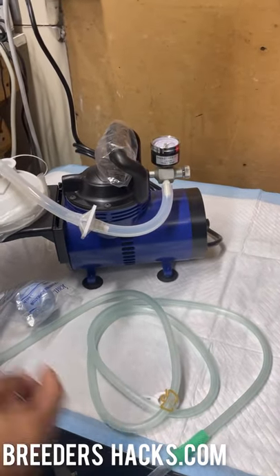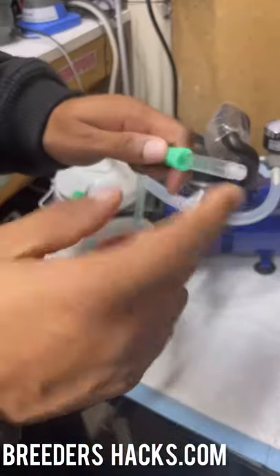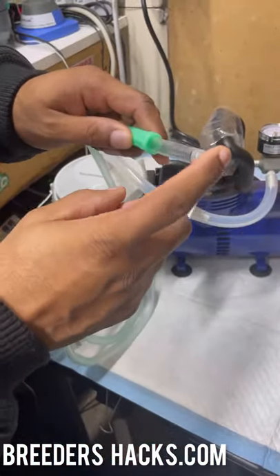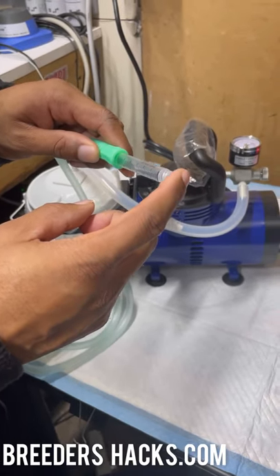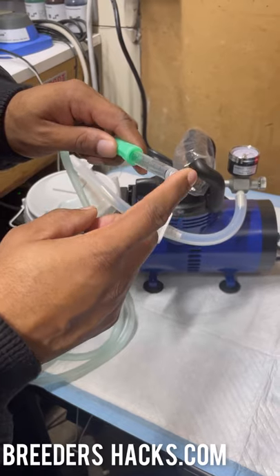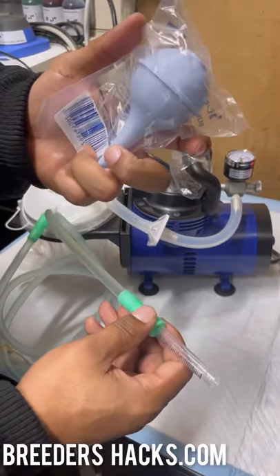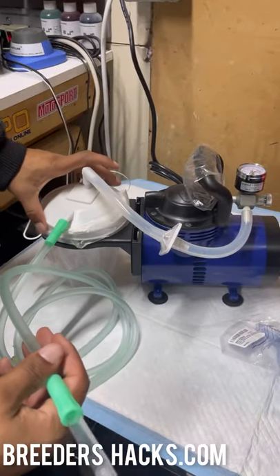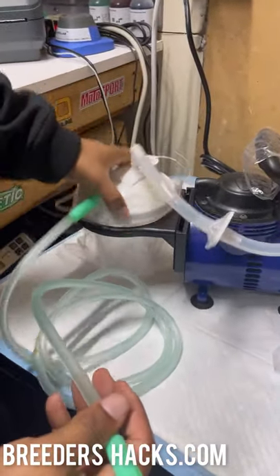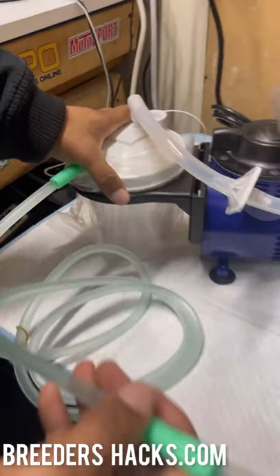As I hold my finger to it, the amount of pressure it can suck out compared to the old handheld aspirator is just unmatched. It'll collect everything right here in this container — you can see how powerful the suction is.